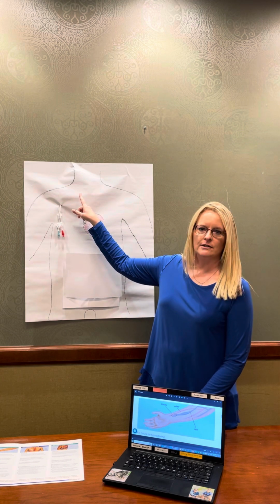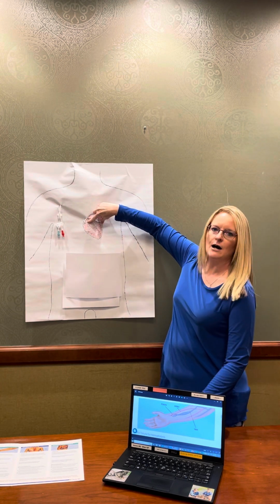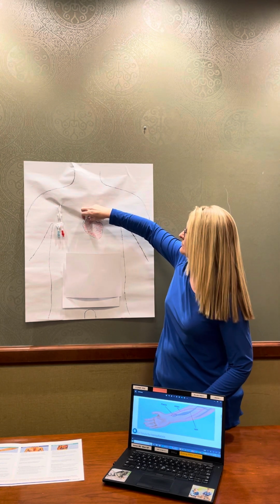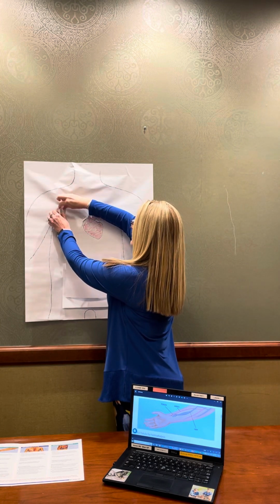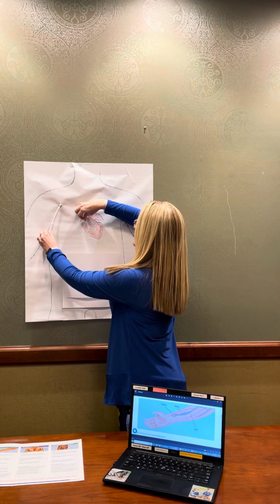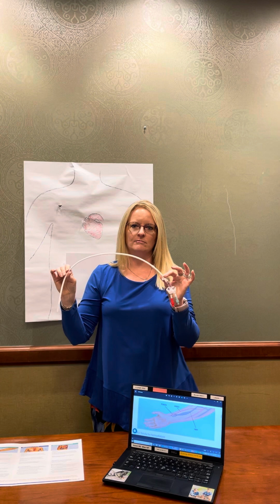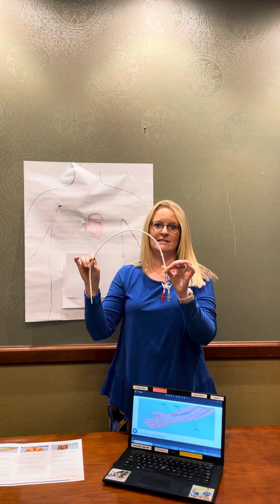It travels and is implanted in the vessel, and the tip ends up going right here in the upper chamber of the heart. This is the least preferred access because it's a foreign object. It is high risk for infection and has many complications. As you can see, a catheter is quite intensive.